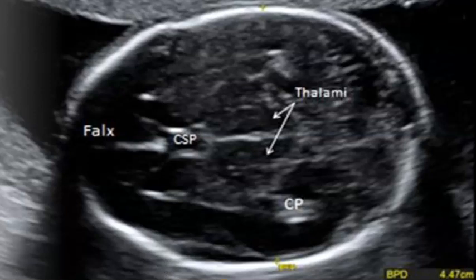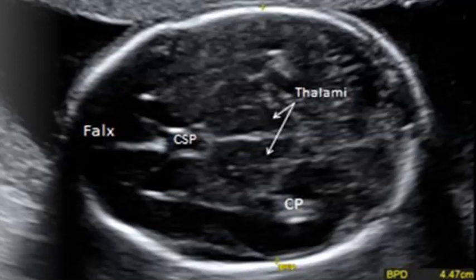To get our biparietal diameter measurement, we're going to image the fetal head in a transverse axial plane. It's a diameter, so we know it's going to be a measurement from one side of the head to the other. If you imagine putting a string at the top of your right ear straight across to the top of your left ear, that's roughly about the level that we're going to be taking our measurement.